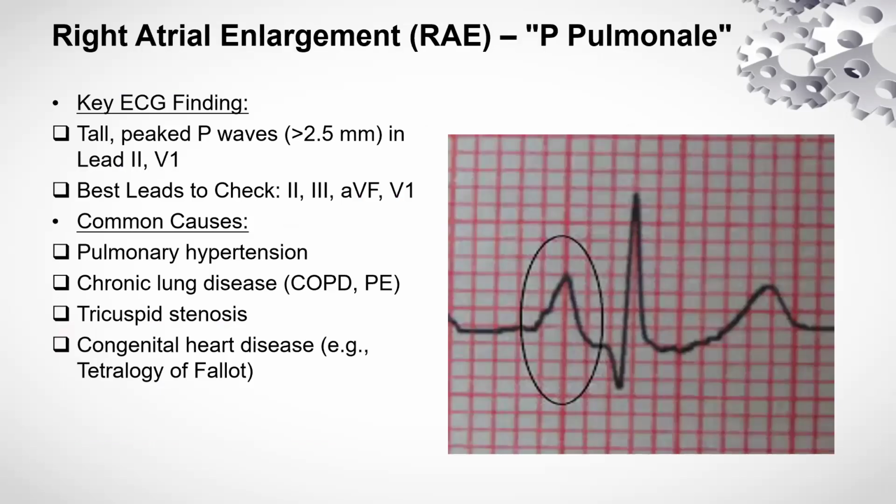So let's look at the right atrial enlargement. I don't think we can finish this lecture today. Let me just take my time. We can reschedule tomorrow. Now look at the P wave here.